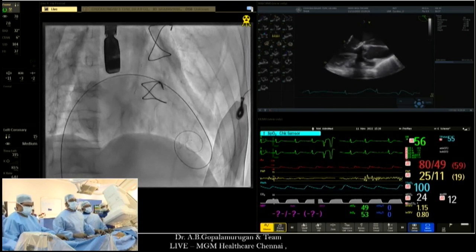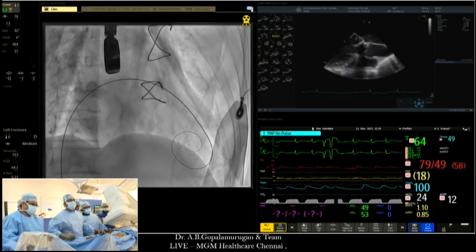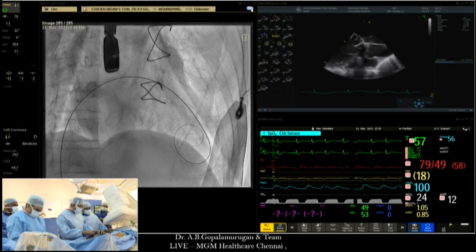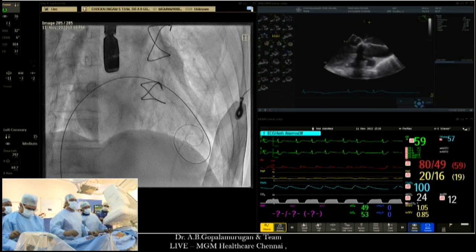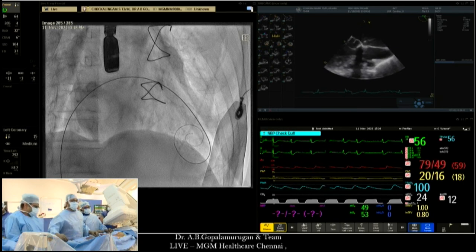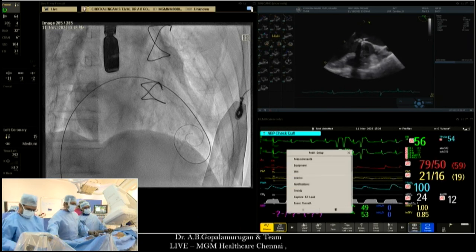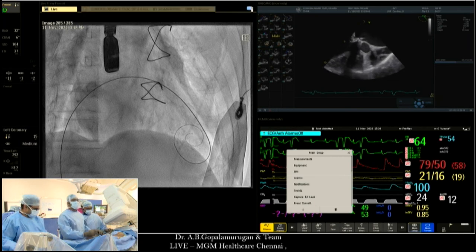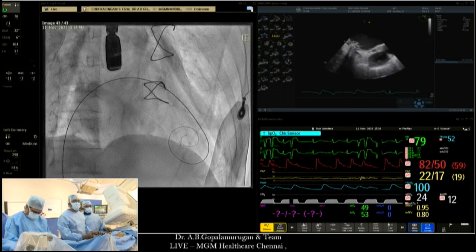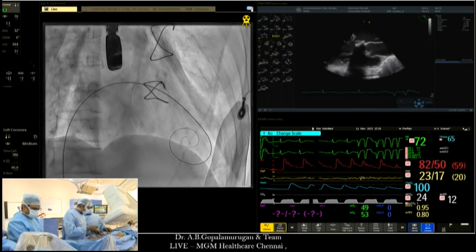Gopal, can you clip a bioprosthetic valve? Yeah. Can you clip? No, clip I wouldn't attempt. I think it's clippable, but I can't see an indication why one would want to clip a bioprosthetic valve, because A, it is the smallest orifice that is available to us compared to a natural valve. Number two, there's no reason to clip, I guess. You would always want to replace it, because if you clip a bioprosthetic valve, it is impossible to have a valve area without stenosis, logically speaking.